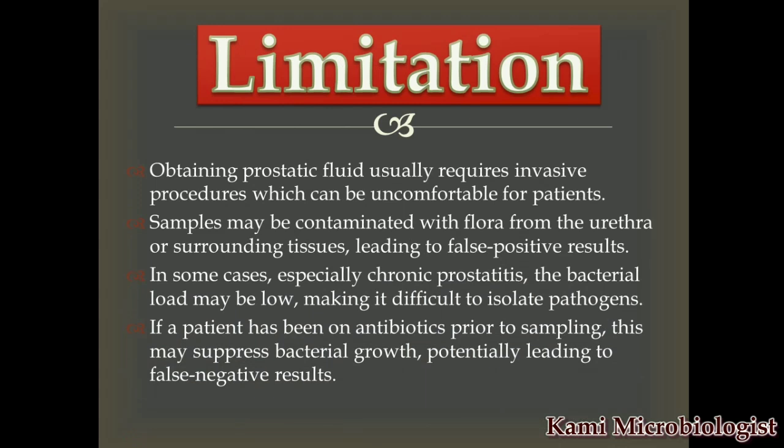Next, let's suppose the patient is using antibiotics, it will also generate a false negative report. Why? Because antibiotics will suppress the bacterial growth, they will not kill the bacteria. If you are not using proper antibiotics, obviously it will suppress the growth of the bacteria and the infection will not be treated. You will generate a negative report, but still the patient will feel infection. So you must guide the patient to stop the antibiotic 1 week before the CS test.